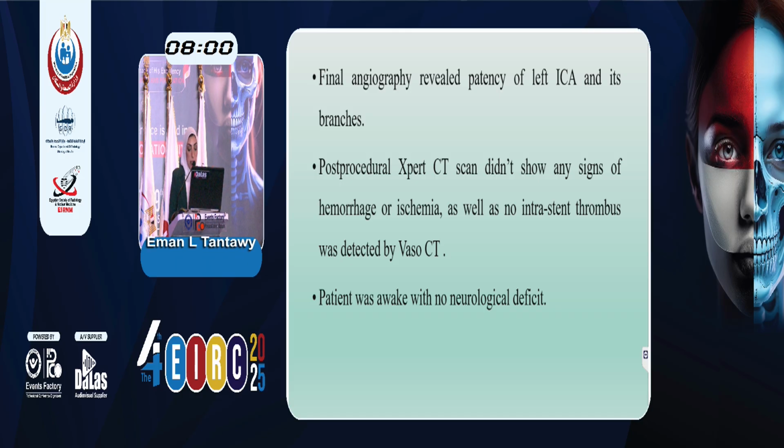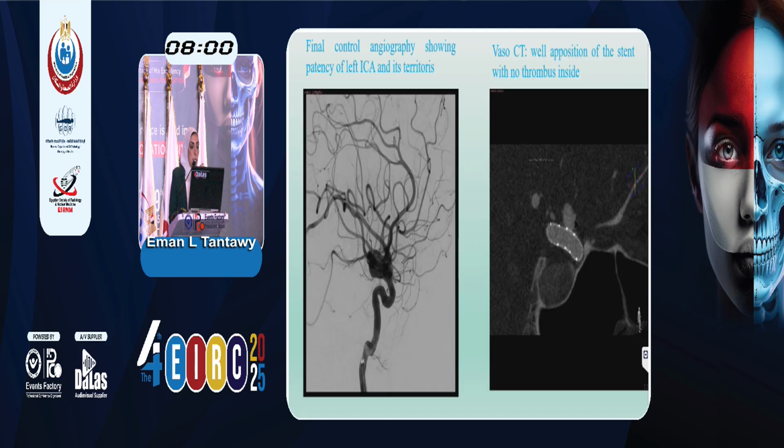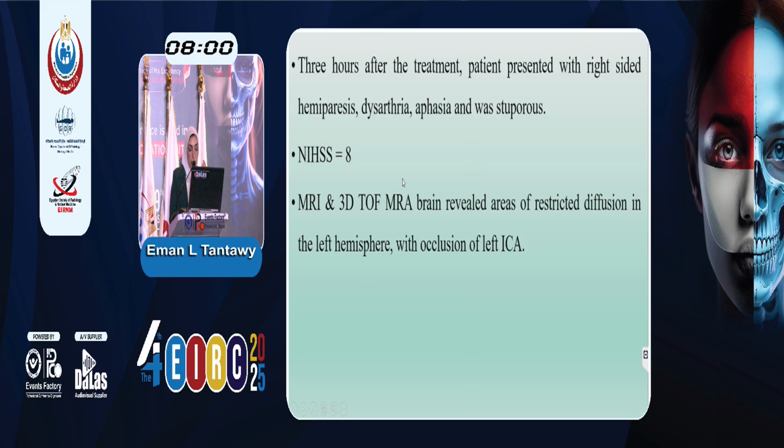The final angiography revealed patency of the left ICA, and the post-procedural Xper CT was very good. Everything was going well. Even on the VasoCT after the procedure, the FRED is very well aligned to the wall of the ICA, with complete patency of the left ICA.